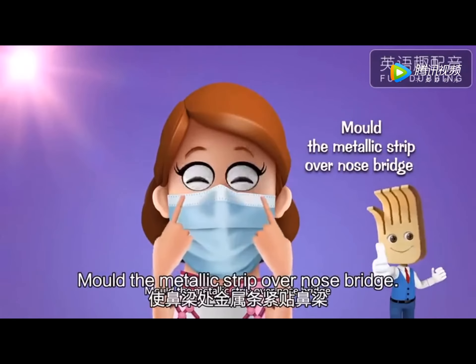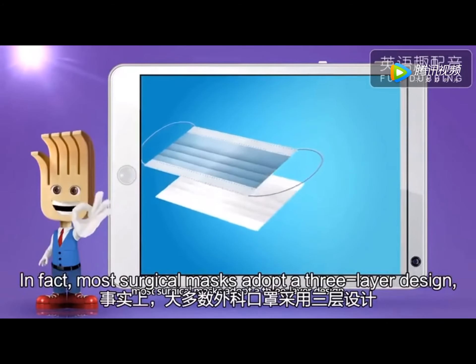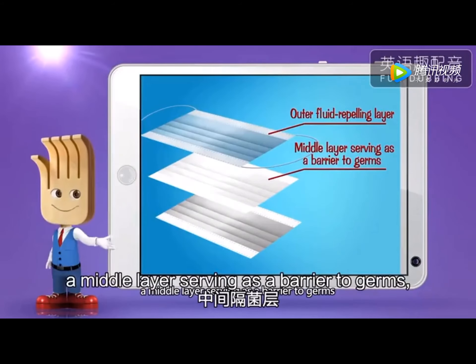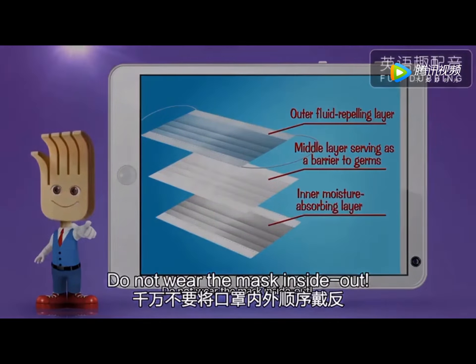Mold the metallic strip over the nose bridge. In fact, most surgical masks adopt a three-layer design, which includes an outer fluid-repelling layer, a middle layer serving as a barrier to germs, and an inner moisture-absorbing layer. Do not wear the mask inside out.